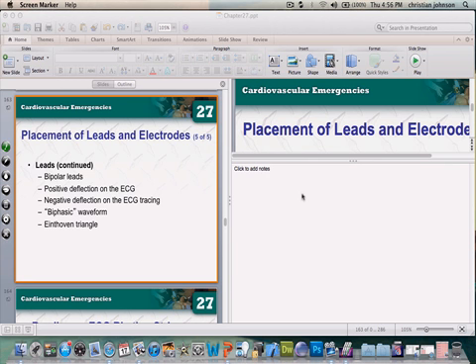All right, back to drawing Einthoven's triangle. Draw it thicker here. Whenever I have electricity flowing towards a positive electrode, it's going to represent positive on the EKG. So we already said my negative lead in lead 2 is my right arm, and my positive lead in lead 2 is at my left leg.